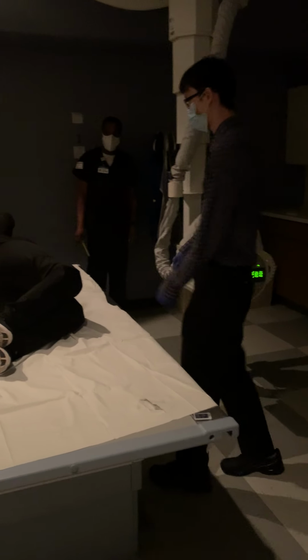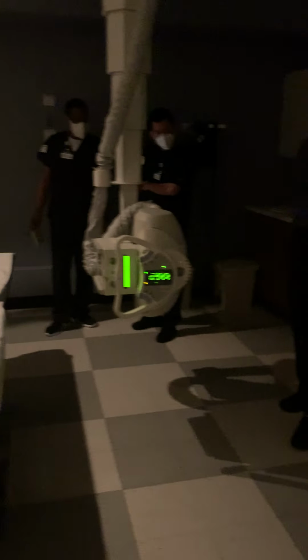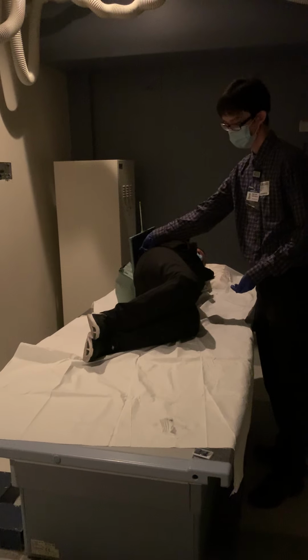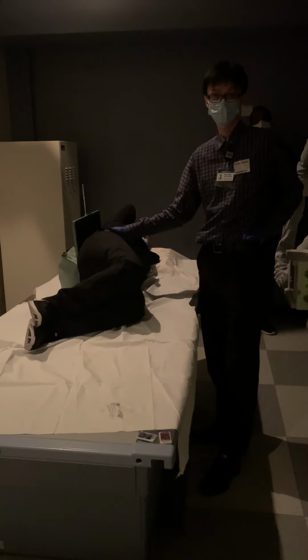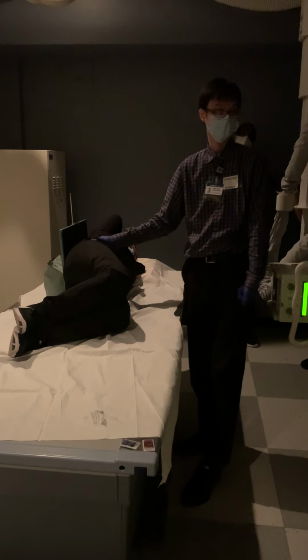What are we going to be looking for in terms of our positioning? Where do we center for the lateral decubitus? Is it attached looking for the diaphragm? We will be looking for diaphragm, yes. So we are going to go 2 inches above the iliac crest. So, is it 2 inches only when you're looking for the diaphragm? Yes, so 2 inches is for the diaphragm. At the iliac crest is when you're guaranteeing the pubic symphysis at the bottom.